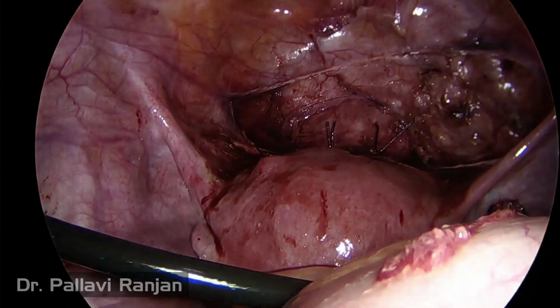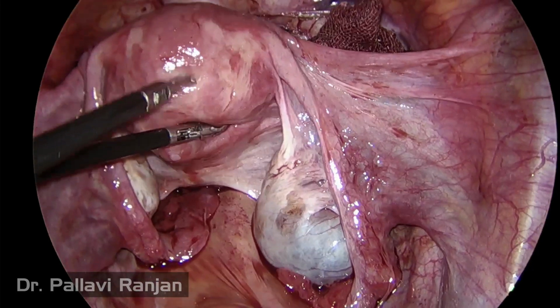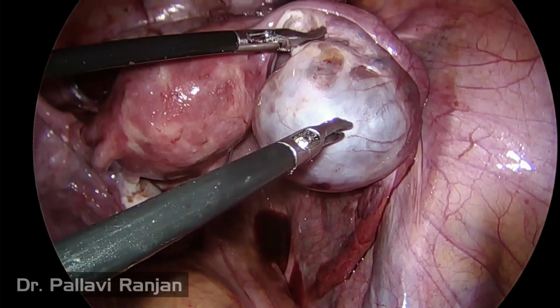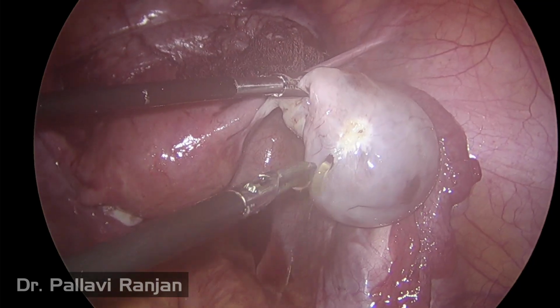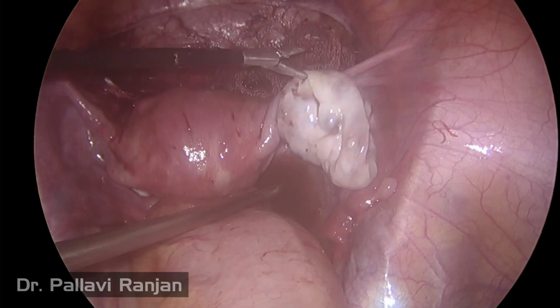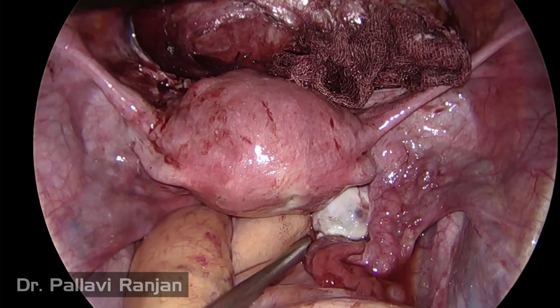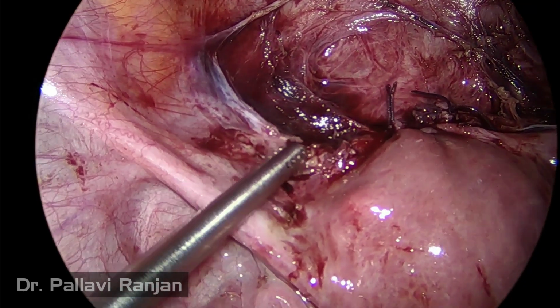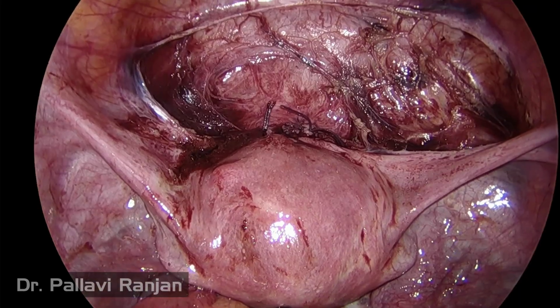There is also a right-sided simple ovarian cyst of 5 centimeters present, so we just drain it. It is most likely a corpus luteal cyst. So the procedure is complete, hemostasis is ensured, and this is the end of the surgery. Thank you.